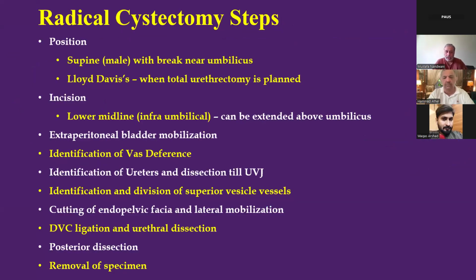First thing, this is the male cystectomy, and this will only cover the cystectomy part, because we have other sessions like lymph node dissection and ileal conduit that we will cover in those other talks. So, positioning wise, this is for the cystectomy.